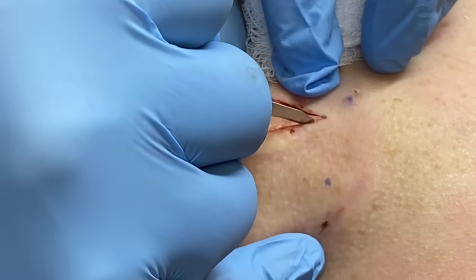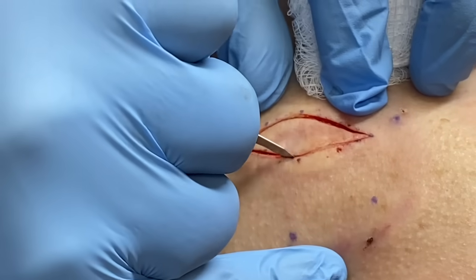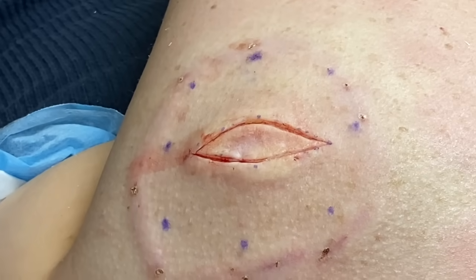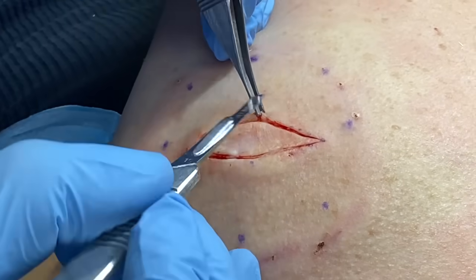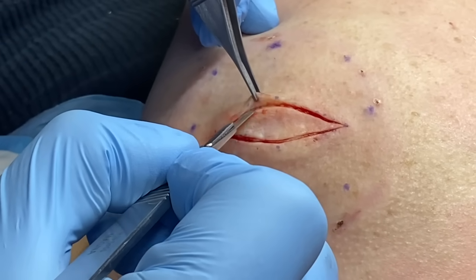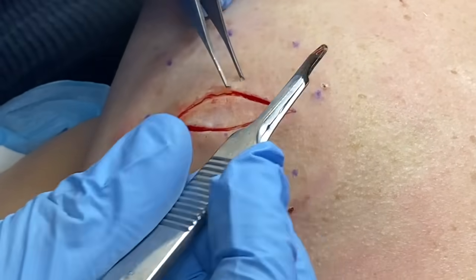So you just want to get like that at the top where that epidermis is. That's good. I don't want to dissect it down in. So once I've gotten a little incision here, we just run the risk of rupturing the membrane. So again, not the end of the world, but generally I want to work with as clean a field as possible and dissect it down, so then we can know that we've actually dissected out the actual membrane. So here, I'll just start taking this. And now the angle at which I dissected down, where I'm holding my blade, this is where those purple marks will delineate. So I've got the end of it through here. If I'm too acute an angle, I'm going to hit the membrane and just mess up the field.